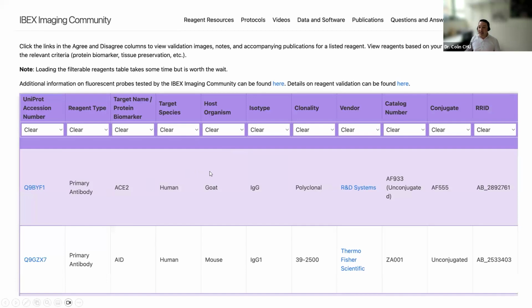And these will be validated by individual users who can use their ORCID IDs to then also say, oh, I've similarly found that antibody works, almost a rating or star system. So then you can look at this and determine which ones might also work for you, and everyone can save more time and money by getting straight to the good answers and good science.